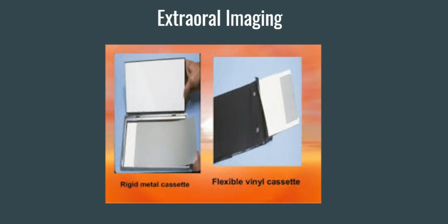This is just a sample of two different types of cassettes. So we have this one here, which would be the rigid, or this one here, which would be the flexible, and this one over here, which is the rigid case.